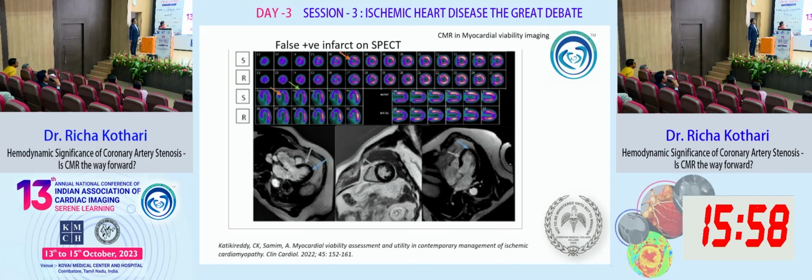So you told that is not viable, but it is showing uptake. No, it is showing uptake. Okay, sir, this is from the perfusion, there is uptake, so it is viable. It is not a false positive actually. Half of the myocardium is showing uptake. So that is one thing.